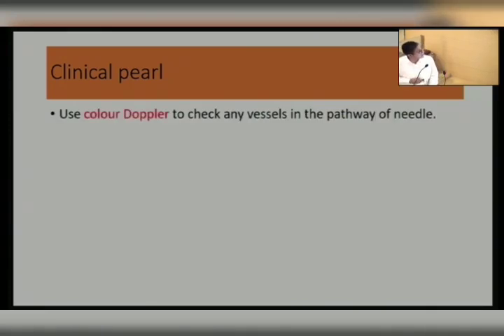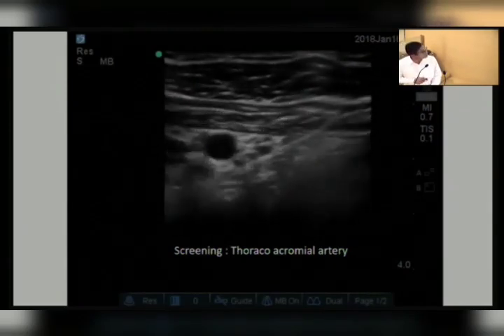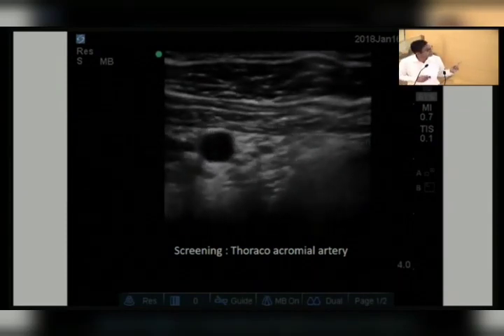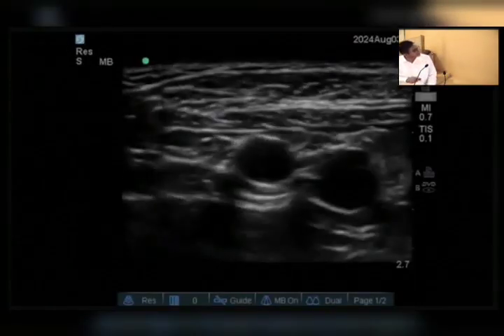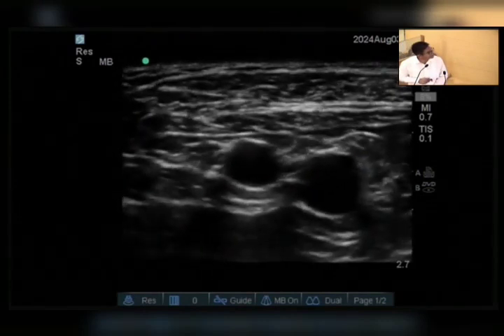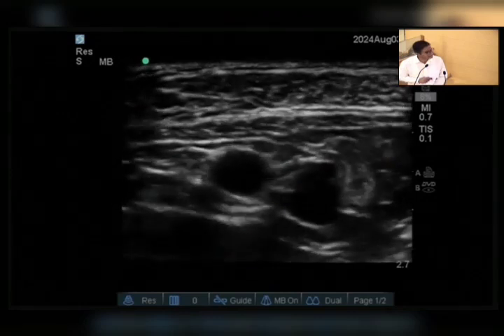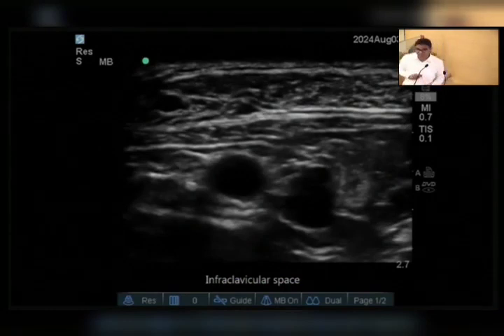So let's see some clinical pearls. In that, always use color Doppler to find out vessels in the pathway of the needle. See the thoracoacromial artery over here, which gives 5 branches over this area that come from this artery somewhere here. And see here the cephalic vein entering toward the axillary vein, and somewhere here you will find the thoracoacromial artery branch coming from the axillary artery. So vessels are normally there, you have to avoid them while scanning and while needling.